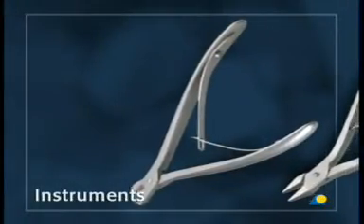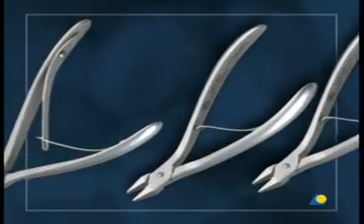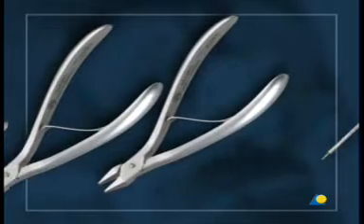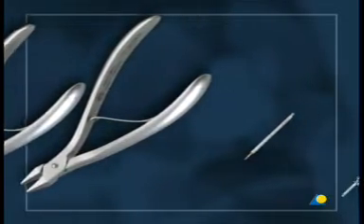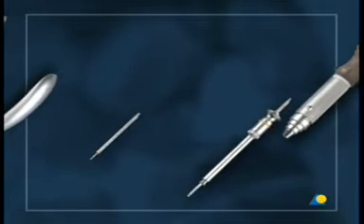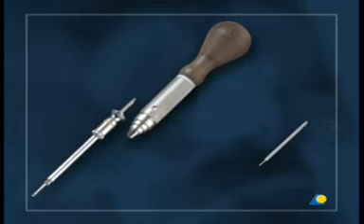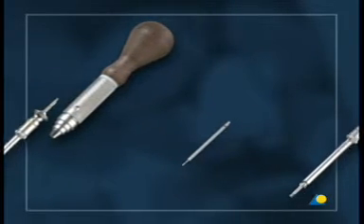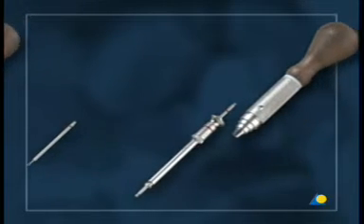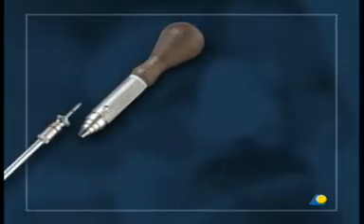The instruments needed are the plate cutters, 2 bending pliers. For 1.3 mm screws, the 1 mm drill bit with 6 mm stop, and the 1.3 screwdriver shaft with holding sleeve and handle. For 1.5 mm screws, the 1.1 mm drill bit with 6 mm stop, and the 1.5 screwdriver shaft with holding sleeve and handle.